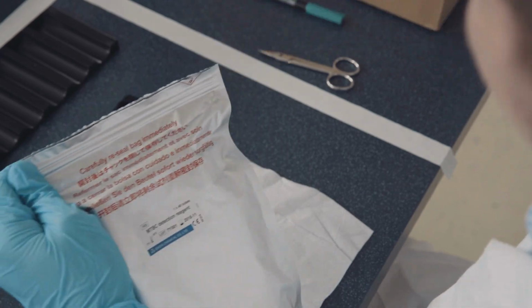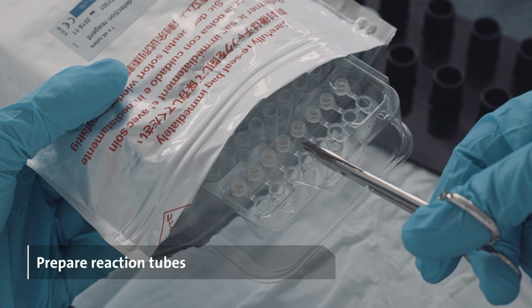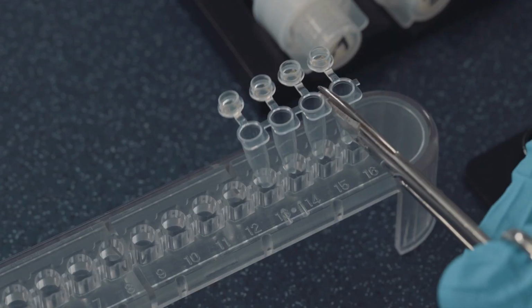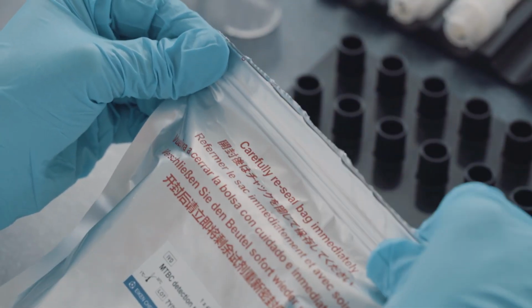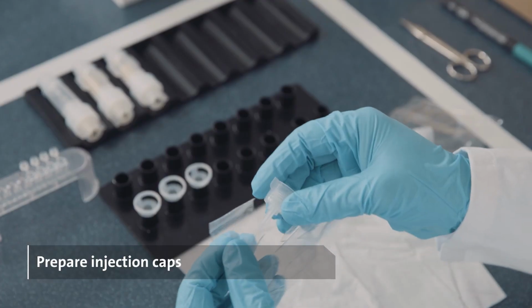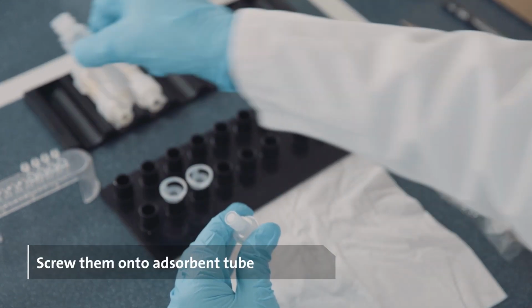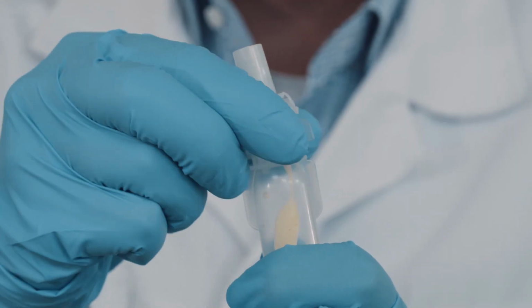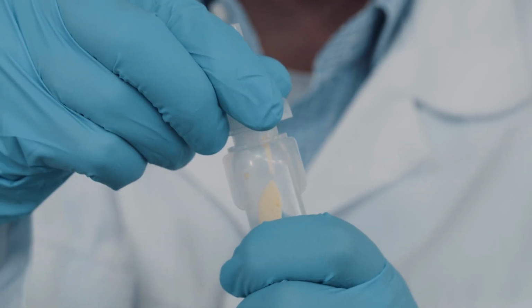Now take the aluminium bag with the reaction tubes out of the Loopamp MTBC detection kit. Take out the appropriate number of tubes, plus 1 for a positive control with the help of a scissor. Do not reach into the bag. Reseal the bag immediately. Take out the appropriate number of injection caps. Put the caps of the adsorbent tubes onto the nozzles of the injection caps and screw them onto the other side of the adsorbent tubes. If the injection cap is not properly screwed onto the adsorbent tube, remove it and repeat the procedure.